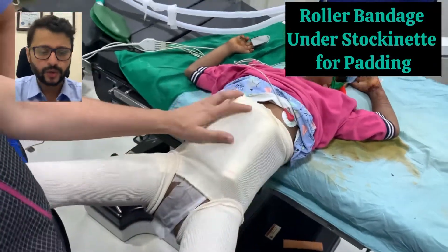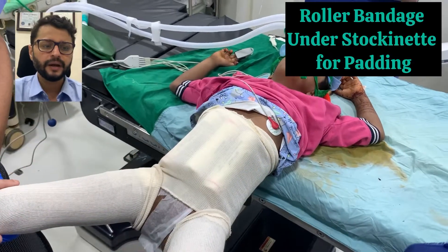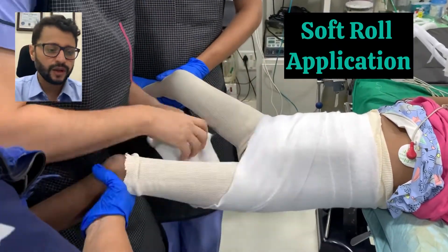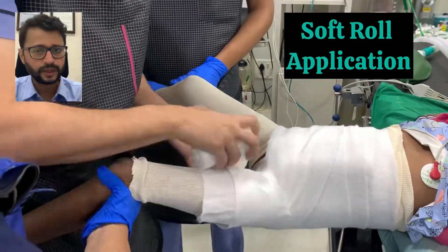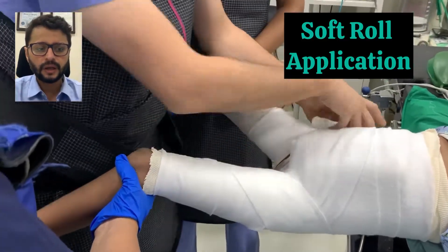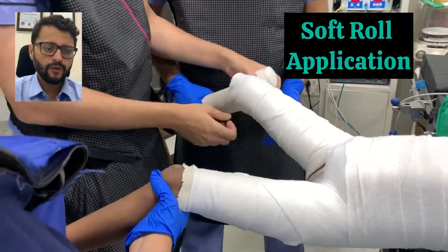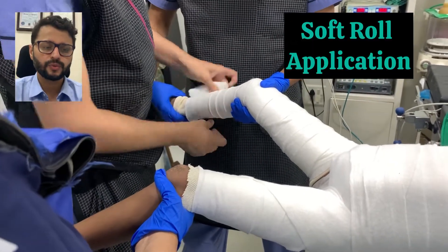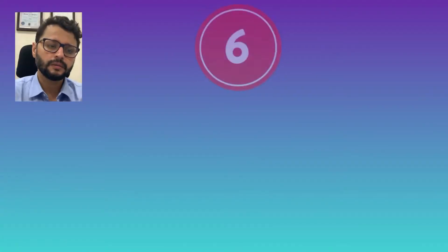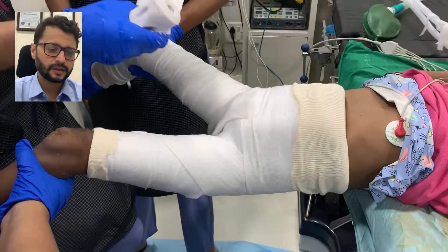Pad the torso well with three roller bandages, usually six inches in length — this gives adequate padding and doesn't make a very tight plaster around the top. Soft roll application is very important; see to it that all bony edges are rolled well, especially the groin area, which needs to be covered well with multiple rolls of soft roll. Other areas can be rolled with single layers. I usually stop the soft roll just short of the heel.